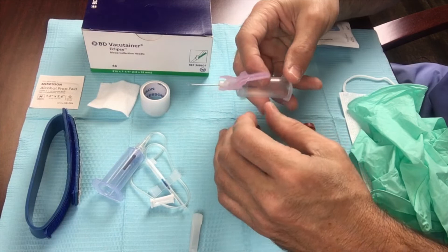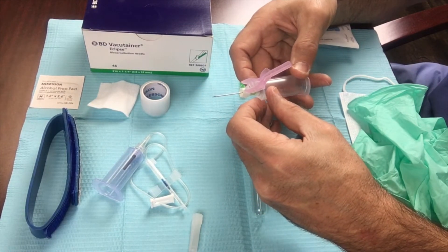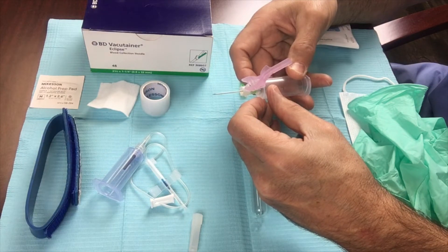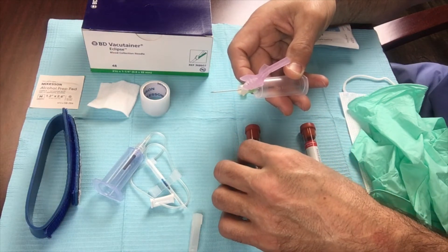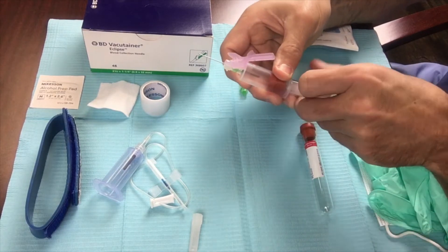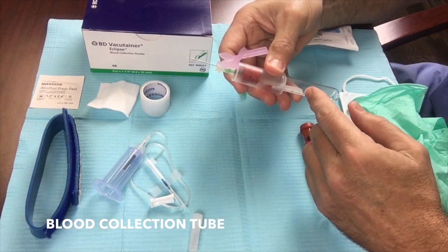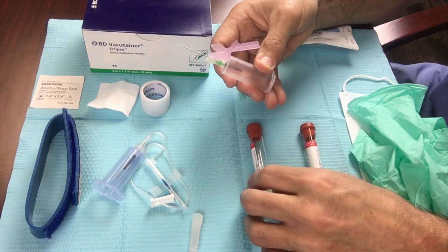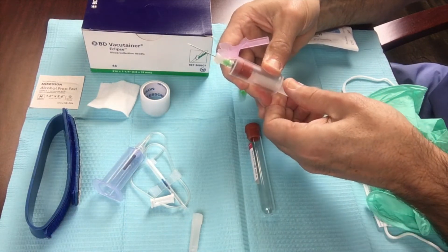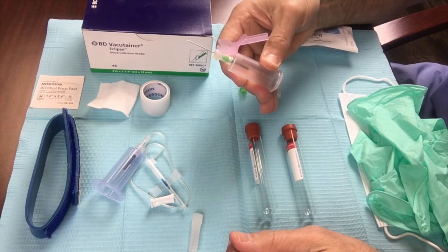Use the beveled edge of the needle and insert it directly into the vein. I use the antecubital fossa vein more often than not — sometimes the forearm, sometimes the hand, just depending on where I can get the best access. But you use bevel up, place that into the vein, and then seat the vacutainer, which is the red top blood collection tube. Blood will fill the tube, then you take it out and go to your second one. Most of the time I'll draw two to four of these depending on how much platelet-rich fibrin and membrane I would like to have.